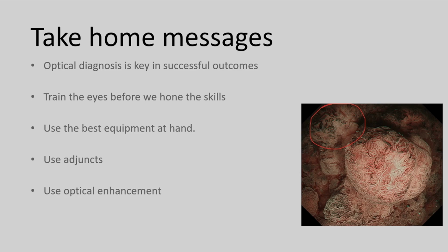So my take-home messages, ladies and gentlemen, and the chairperson, is optical diagnosis is key in successful outcomes. We need to train our eyes, we need to train our juniors' eyes before we hone our skills. We try and jump to learn ESDs, but we try to avoid the pit pattern recognition, trying to assess those things in deeper depths.